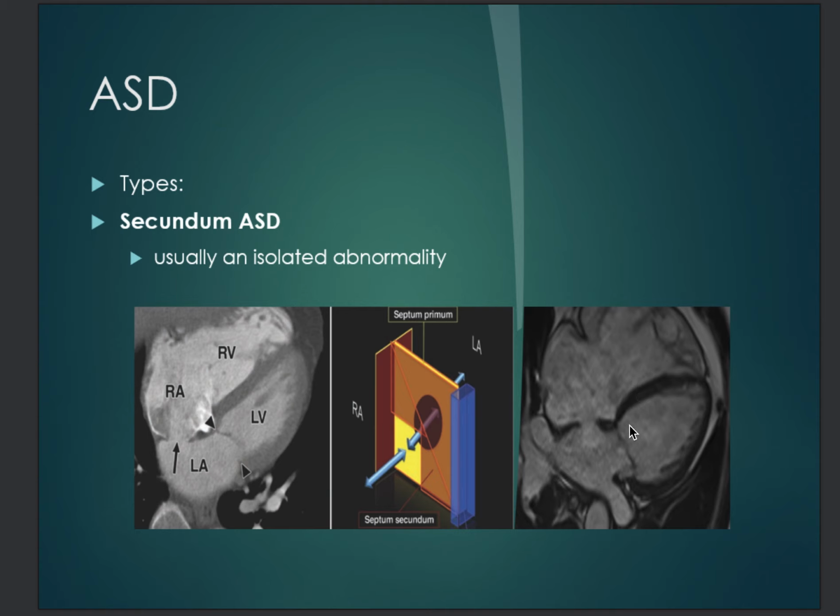So it's important to comment on the amount of the shunt, but not only that, because sometimes you would see a significant ASD but the shunt is small, which is bad news because this might reflect Eisenmenger syndrome or pulmonary hypertension. The next point to comment on, which is very important, is whether there is tricuspid regurgitation, hypertrophy, or dilatation of the right ventricle, or dilatation of the pulmonary artery. Those are the signs from cross-sectional images that might indicate a high pressure.